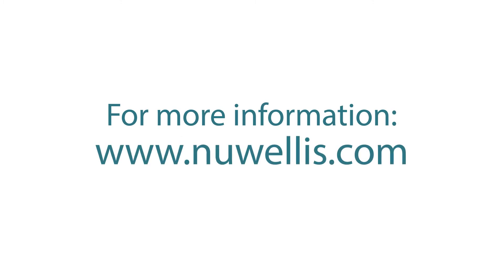For more information on the Aquadex SmartFlow system, please visit nuwellis.com.